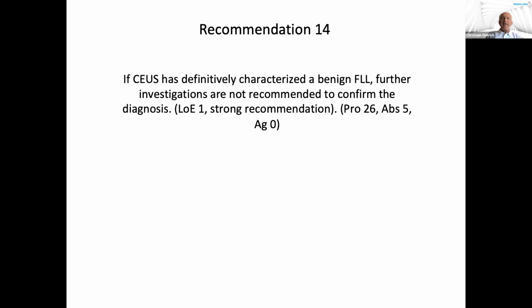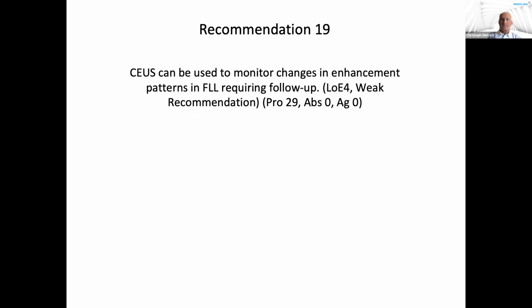If CEUS has definitely characterized a benign focal liver lesion, further investigations are no longer recommended to confirm the diagnosis, because it's clear hyperenhancement in all phases. CEUS can be used to monitor changes in enhancement patterns of focal liver lesions requiring a follow-up.